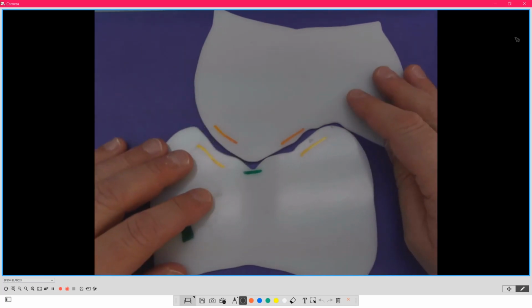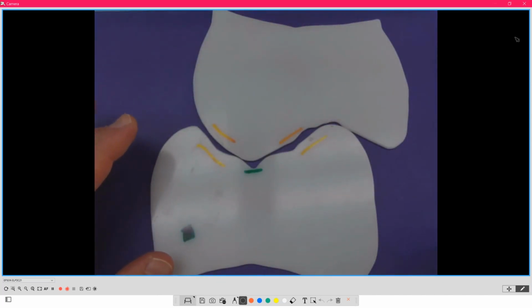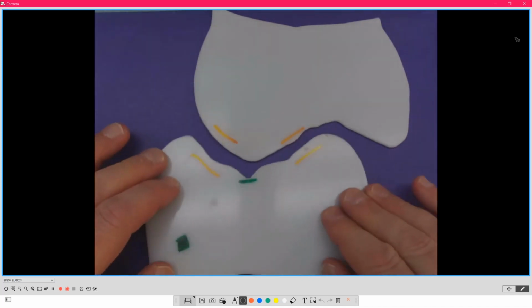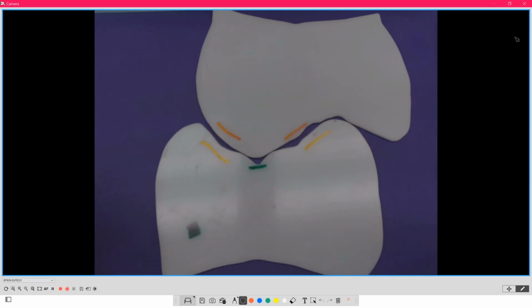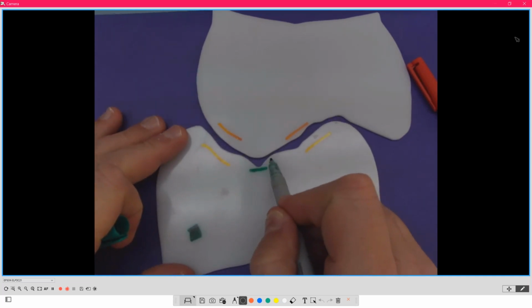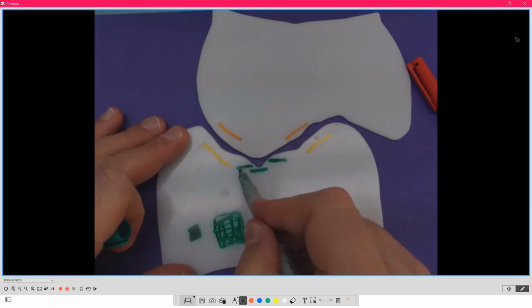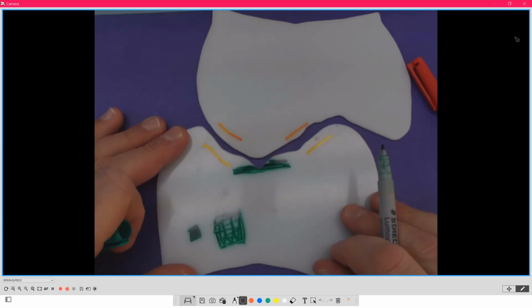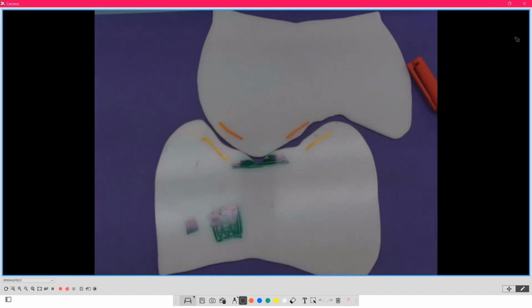Okay. So I wanted to again show you the freedom, the guiding planes, the hit and slide, that you don't want the bite locked in and knuckle tight. That's not good. It doesn't function like that. And the patient functions in a chew cycle, okay? And we don't want the hit and slide. The hit and slide is what causes all of our grief. It is the number one cause of our grief. And as the patient gets older, they have less tone, less neuromuscular and muscle tone. So then I can actually come in and all I do is grind here and make that 1 millimeter box bigger and go 2 millimeters, because I'm making this platform or the helicopter pad bigger.